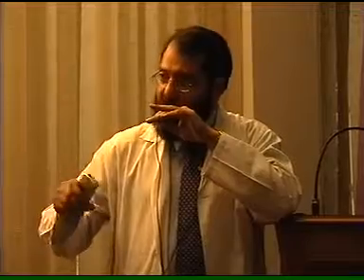So therefore, you have to remember the QT interval. The QT interval has to be adjusted with the heart rate. It is called QTc, C for corrected. So it is corrected for the heart rate, and you have to adjust that according to the heart rate. I'll come to that in the next few minutes. So remember the QT interval, remember the QRS interval, remember the PR interval.